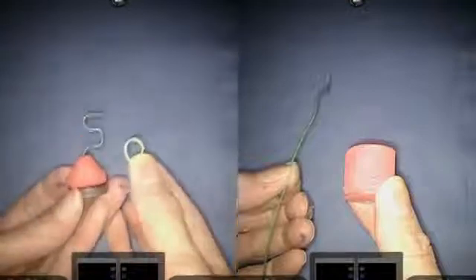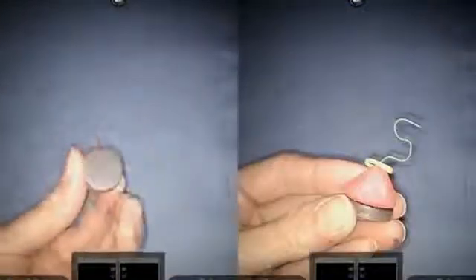The prototype device in this video was built with simple household materials including an 8-inch styrofoam ball cut in half, felt material, foam shapes, wire, magnets, hair ties, puff paint, shirt buttons, and a latex swimming cap.